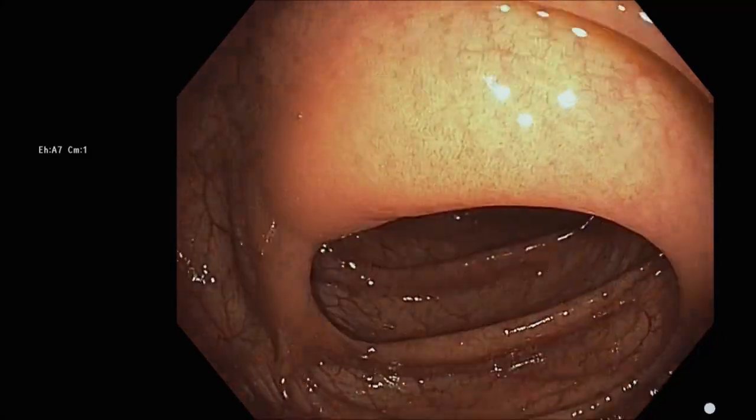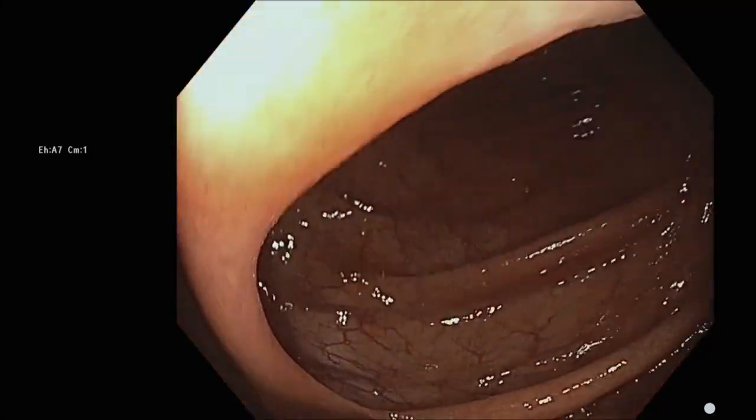This is a fabulous way to get in when you are struggling and you can't get the valve turned toward you, and it's especially useful if you have a device on to improve visualization, like the Endocuff Vision or Amplify. I'll demonstrate this underwater technique a couple of times because, again, I think it's underused.